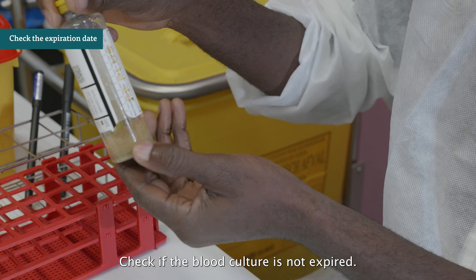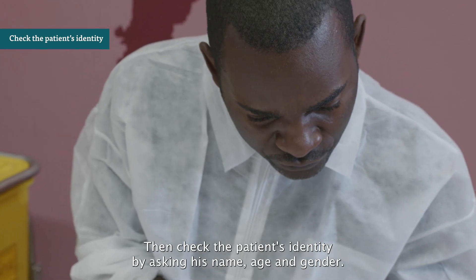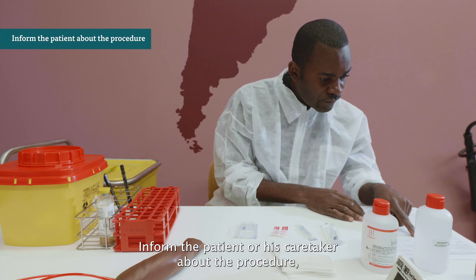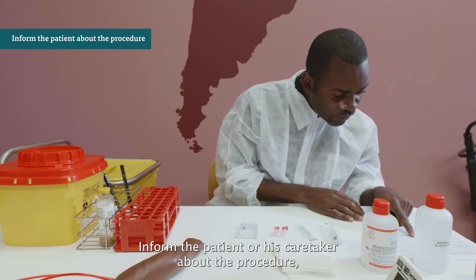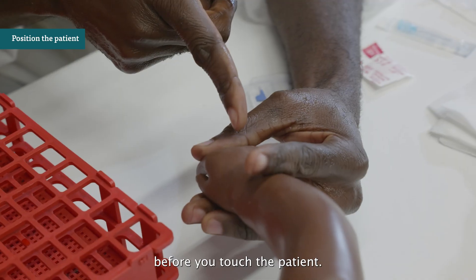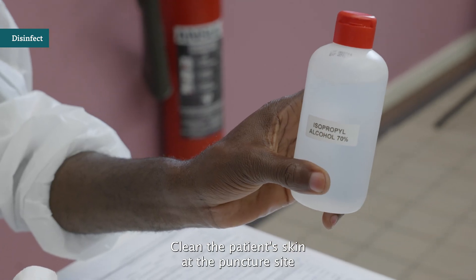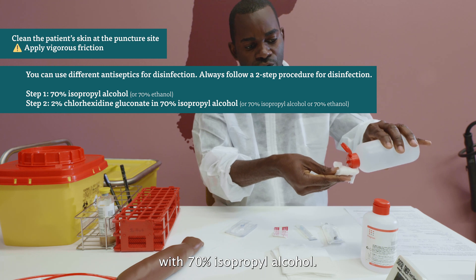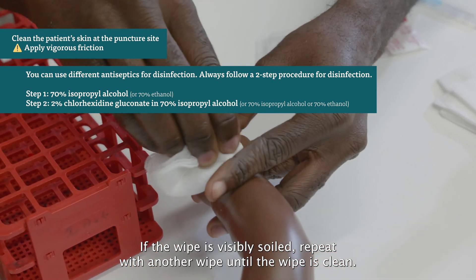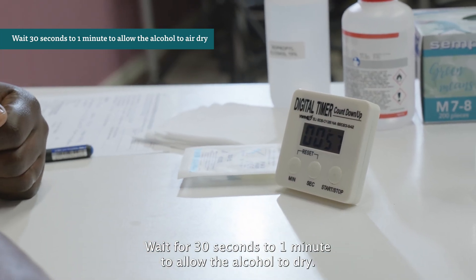Check if the blood culture is not expired and check the patient's identity by asking their name, age, and gender. Indicate the volume of blood you need to sample per blood culture bottle. Inform the patient or their caretaker about the procedure while you disinfect your hands with alcohol-based hand rub before you touch the patient. Position the patient and look for an appropriate venipuncture site. Clean the patient's skin at the puncture site with 70% isopropyl alcohol, applying vigorous friction. If the wipe is visibly soiled, repeat with another wipe until the wipe is clean.